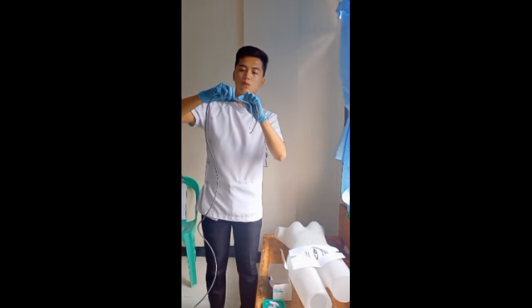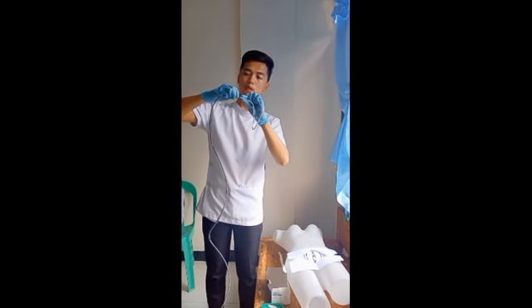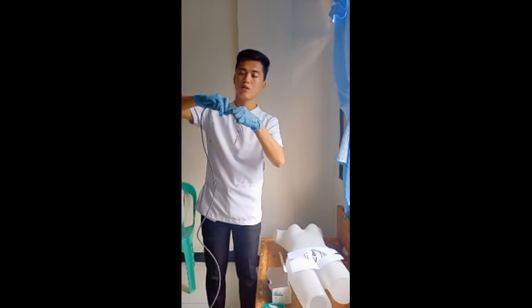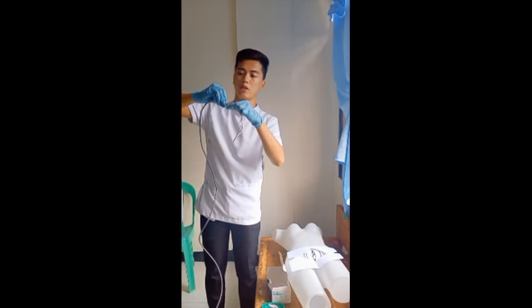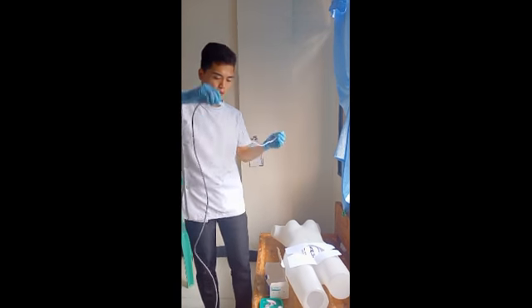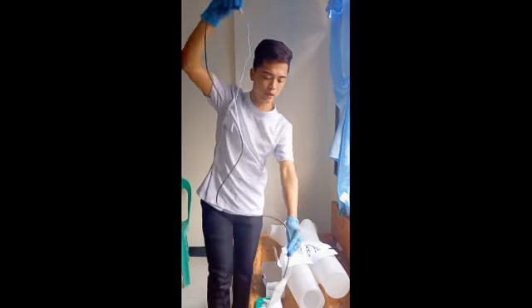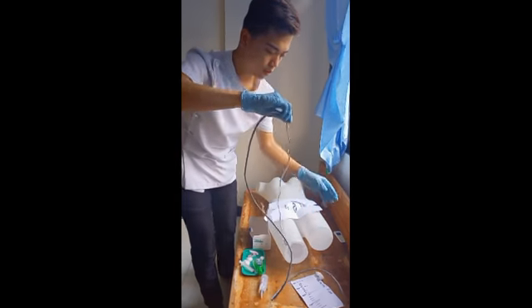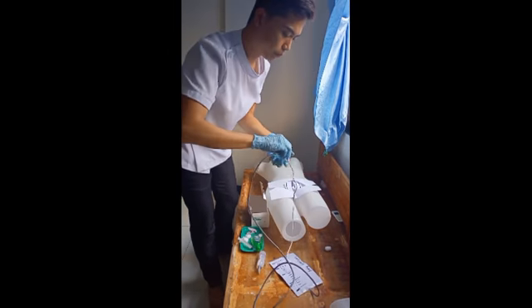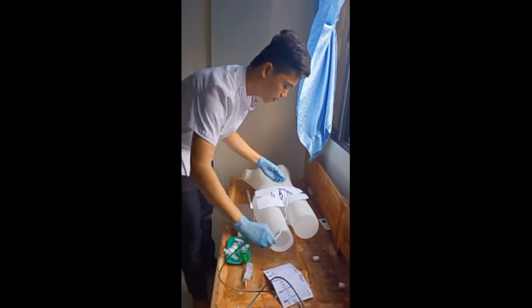You need to use this procedure to get the urine on the bladder of the patient. Let's assume I put it in here in this procedure.